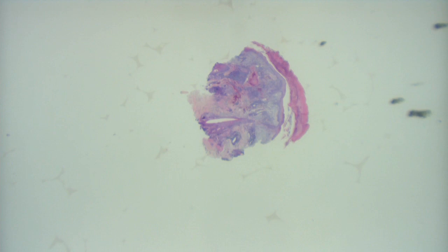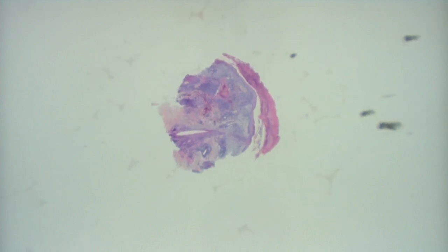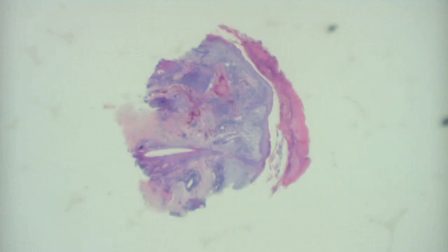All right, let's try this one. We have a small biopsy, lots of crust, kind of serum crust at the top, and then a lot of inflammatory infiltrate in the dermis.